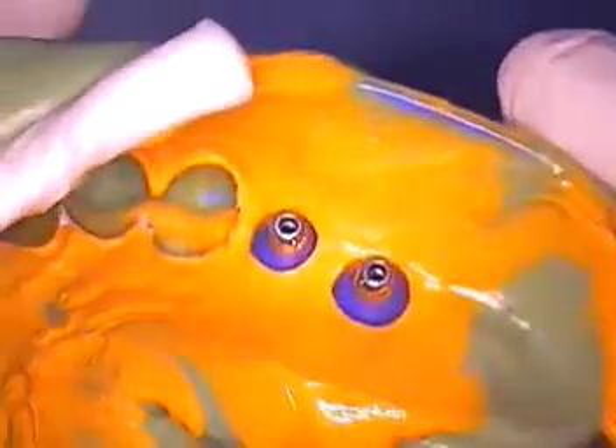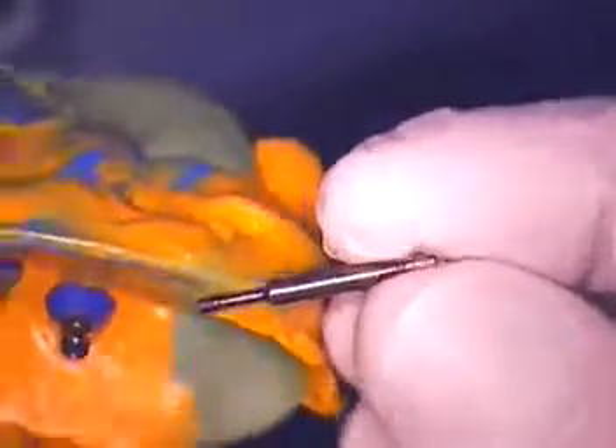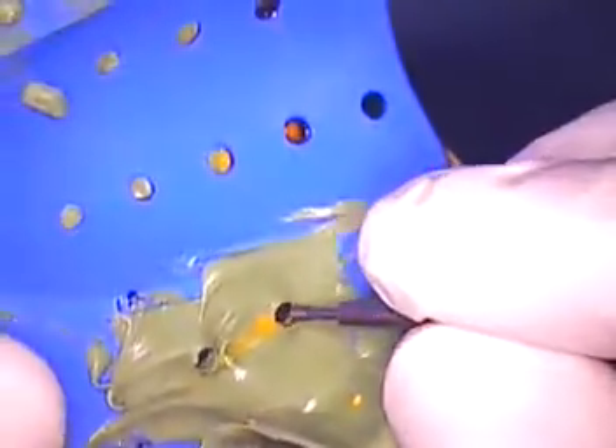Back to the impression. Some of the pitfalls to watch out for when you're putting your analogs in place and using the long screws that come with these — what Straumann has done is they changed their design and also these screws, so be careful, don't mix and match these. They are different.